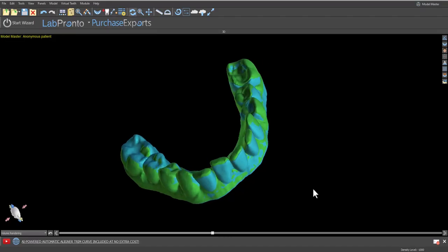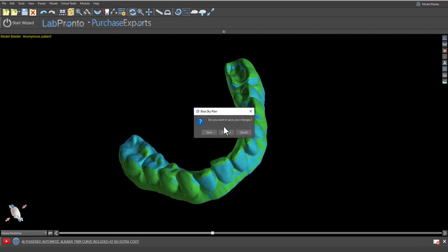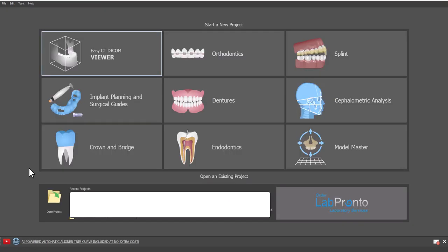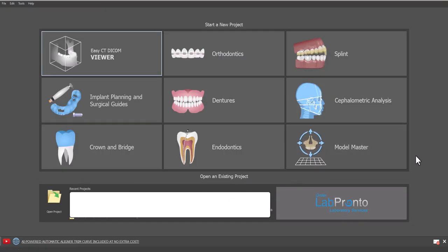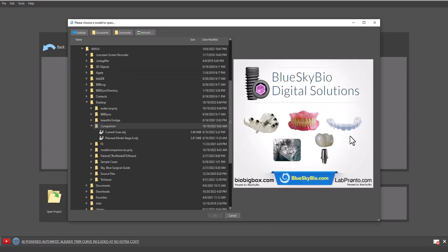This process can be done in the current live version of BlueSky plan. I'm currently demonstrating it in a beta release of our upcoming release where we've renamed the model editing module to the model master module. So I'm going to go ahead and start the process by clicking on model master, choosing import models.